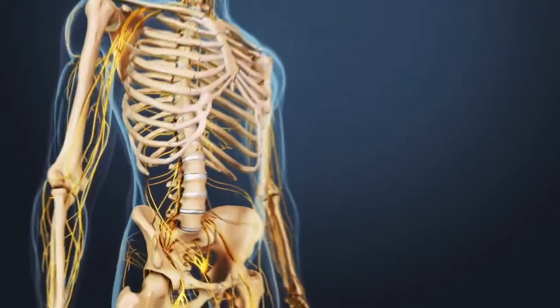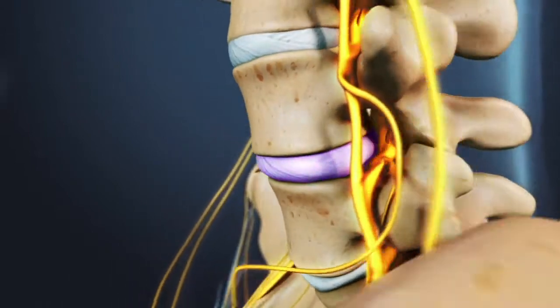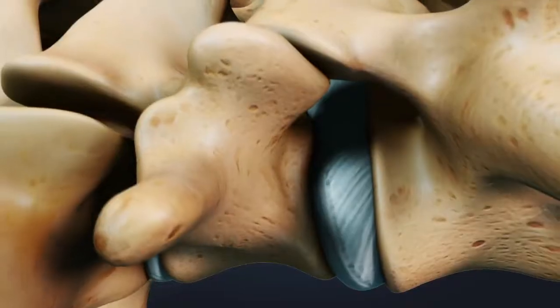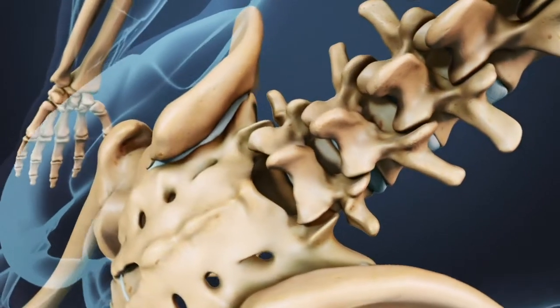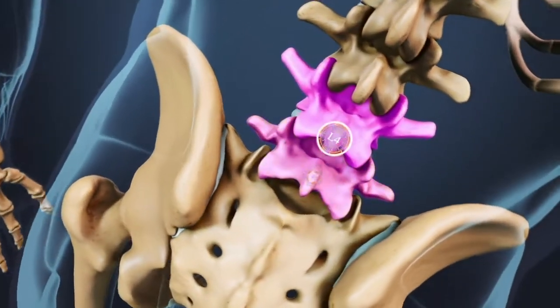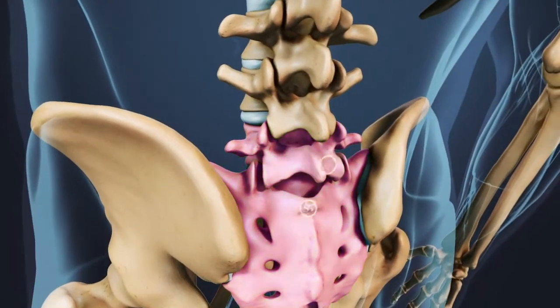A posterior lumbar interbody fusion, called a PLIF, is a surgery designed to stop the motion at the targeted segment of the spine. A PLIF is done in the lumbar or lower spine, most commonly performed on the L4 through L5 or L5 through S1 segment at the bottom of the lumbar spine.